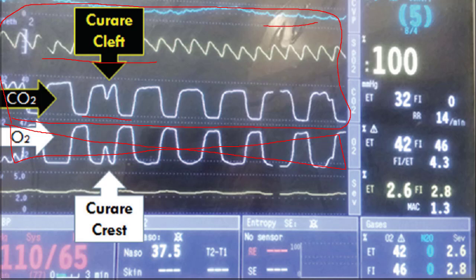I guess this looks like possibly an EKG, those type of things. Okay, actually that may be hemodynamic monitoring up there, but you get the idea. So when airflow monitoring becomes a big deal, which I think it is in 10 years, you will have a fourth dimensional assessment as well. And I think that's going to be very useful.